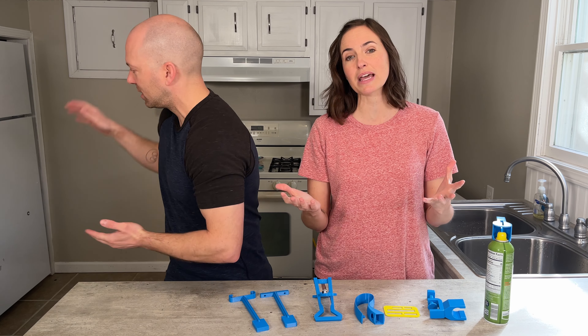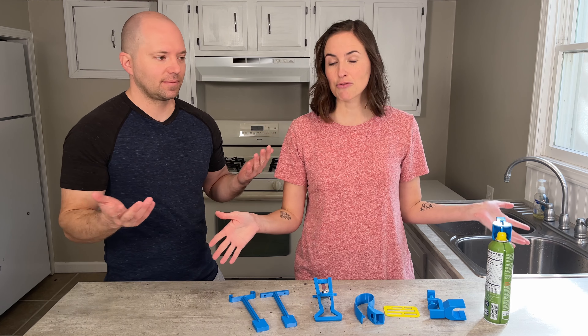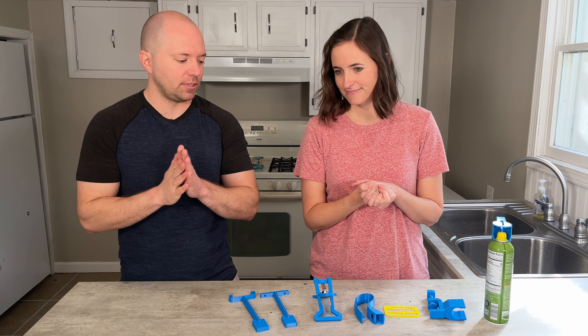Hi everyone, it's me Lindsay with EquipMeOT, here today to talk about something pretty special. We're going to be talking about 3D printed adaptive equipment, and I couldn't do this alone so I brought in the guy behind the camera, my husband Adam, to help us go over this as he's been extremely helpful in getting 3D printed products into my house — he bought a 3D printer recently.